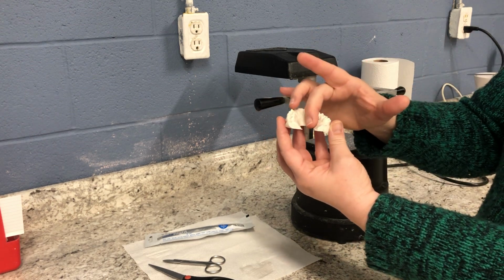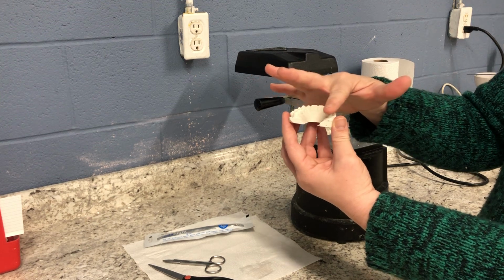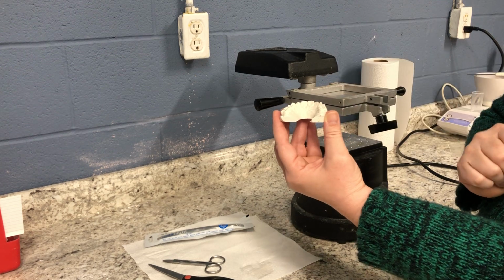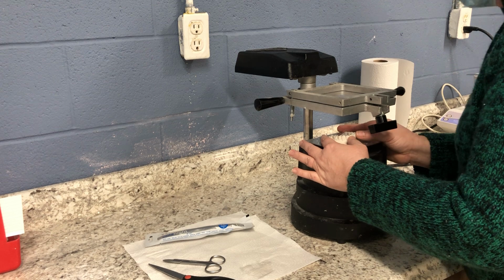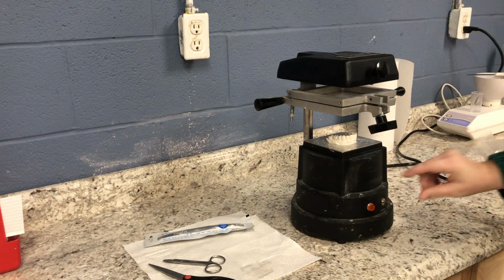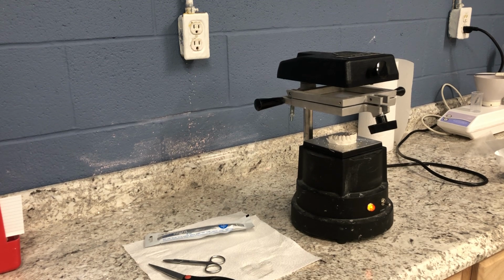You want it to just all suck down over it evenly. And if that palate is still there, it's not going to do that, and it's just kind of going to lay flat instead of contouring around the anatomy of the teeth on the lingual. So let's place this under here, and then we're going to pull this top part around and turn the heat on.